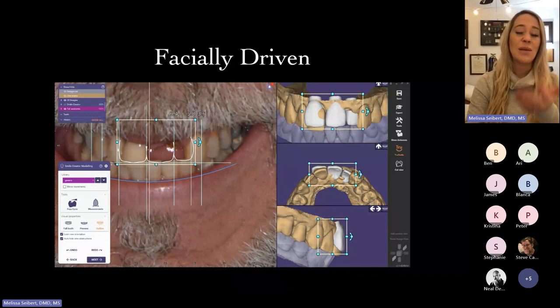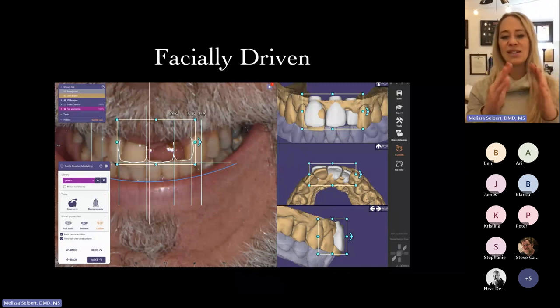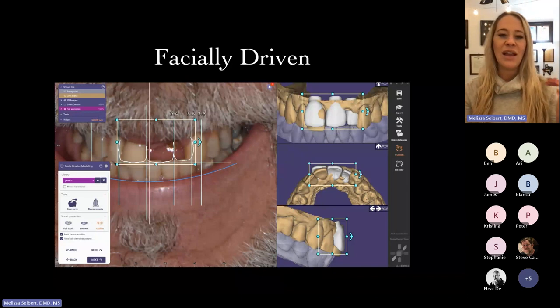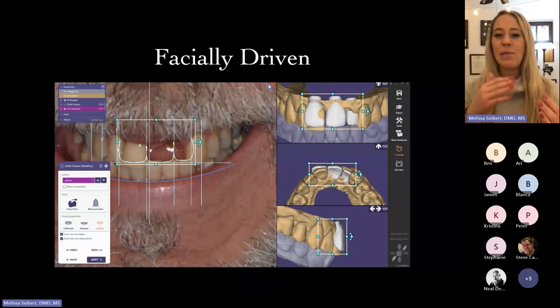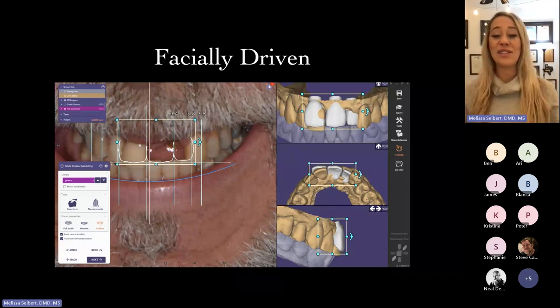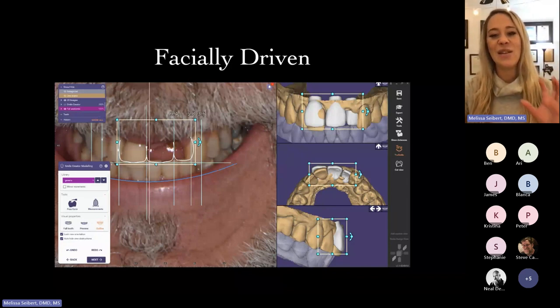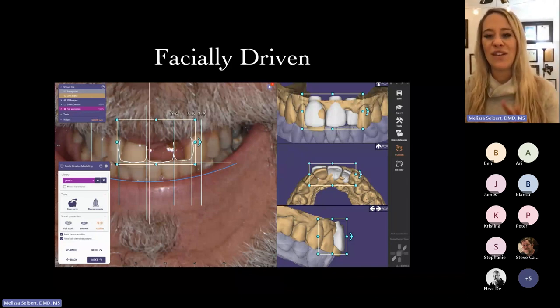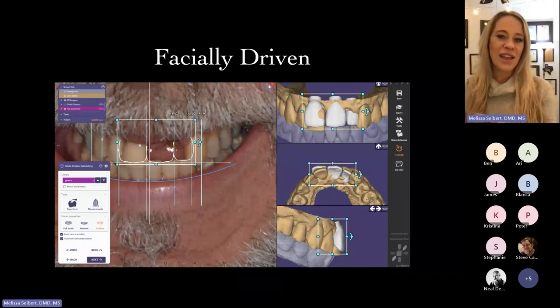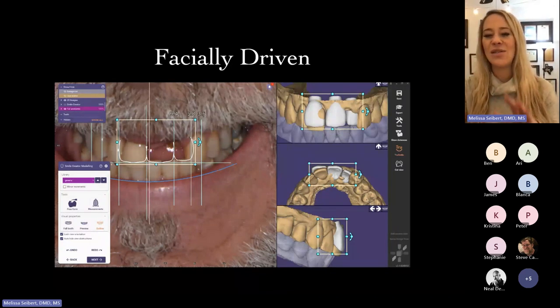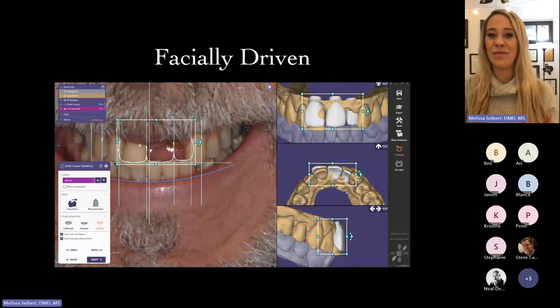You couldn't see the way it followed the smile line. Ideally, we want the incisal edges to follow the patient's smile line, and we want to keep in mind how much of their gingiva is shown when they're smiling. With this feature, this is a case where the patient was missing teeth 9 and 10, and I'm actually using their smile to design everything.